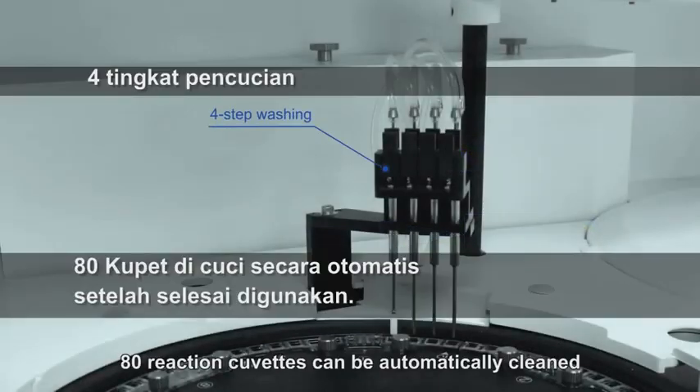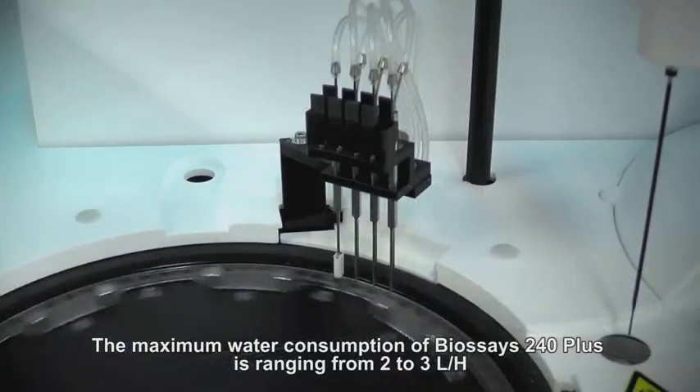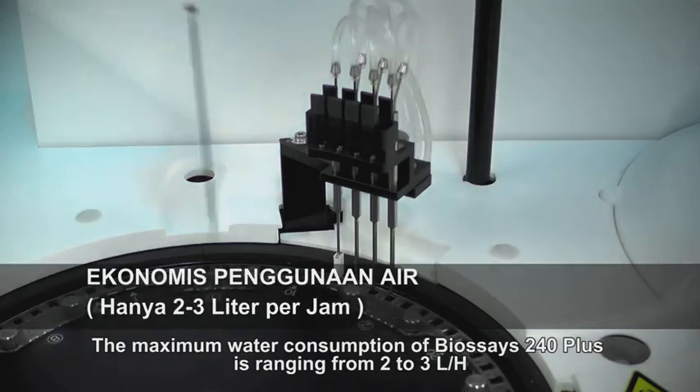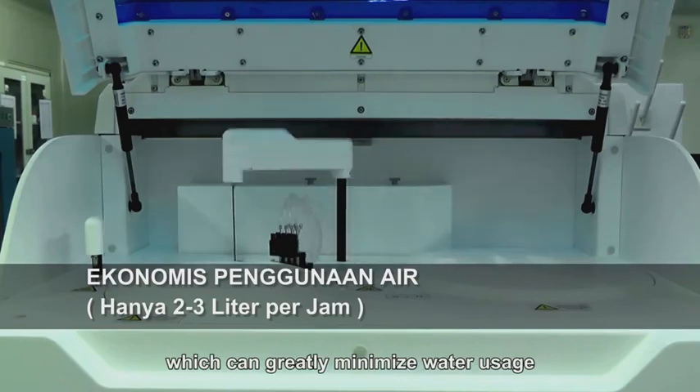80 reaction cuvettes can be automatically cleaned by a station with a 4-step washing procedure. The maximum water consumption of Biossays 240 Plus ranges from 2 to 3 liters per hour, which greatly minimizes water usage.